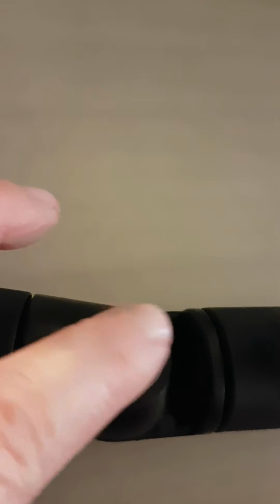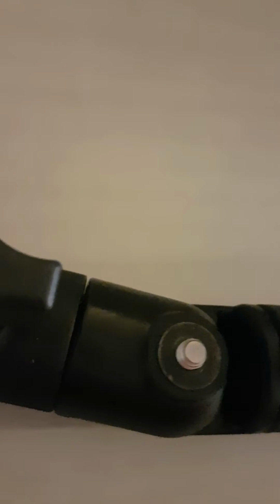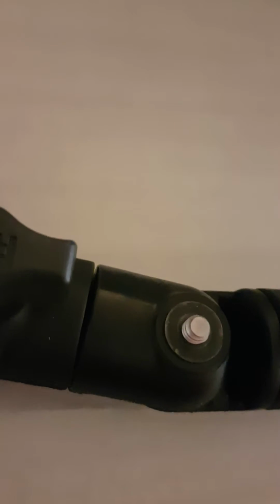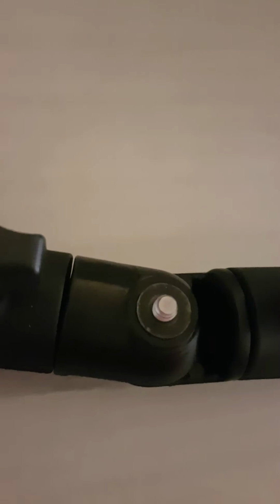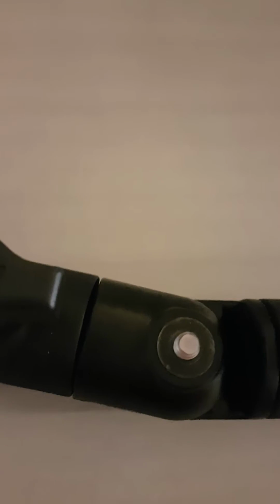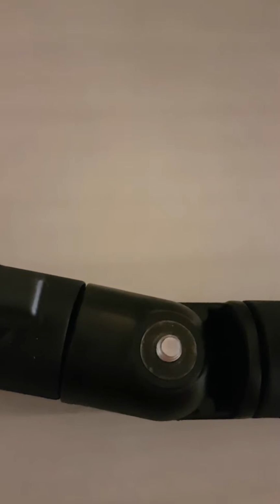Once you take off the cap, you've got a couple of little washers in there to keep everything in place. Now, what I did is I used some Loctite. Loctite, by the way, is Loctite Blue, not red or any other color. It's a thread locker. You put a little bit on the screw, let it sit overnight for about a day or so, and it will keep everything from moving, even with heavy vibration. It'll keep that thing totally still.